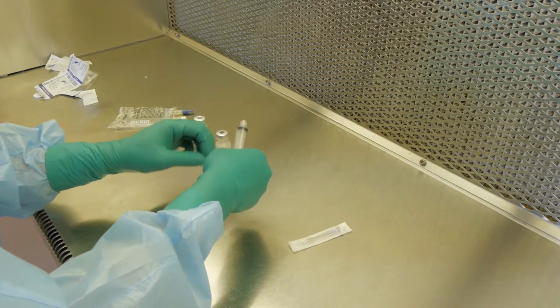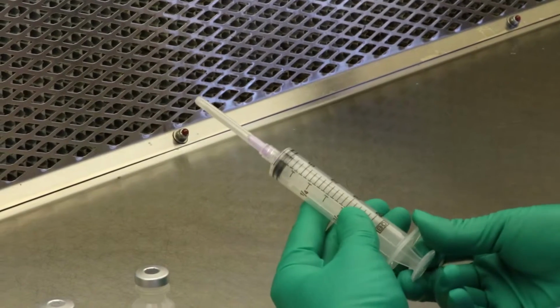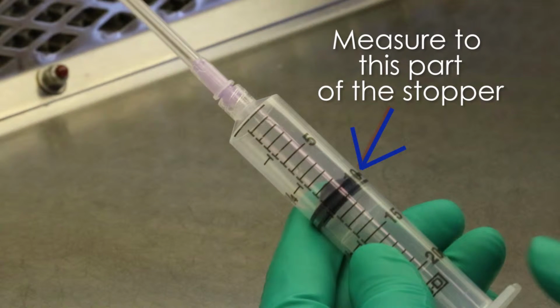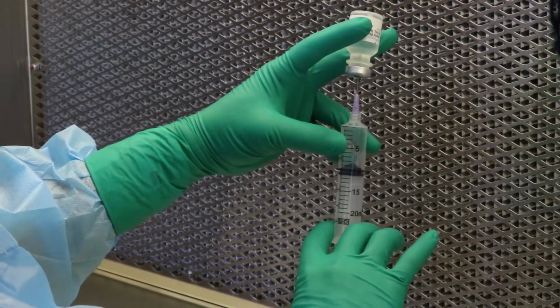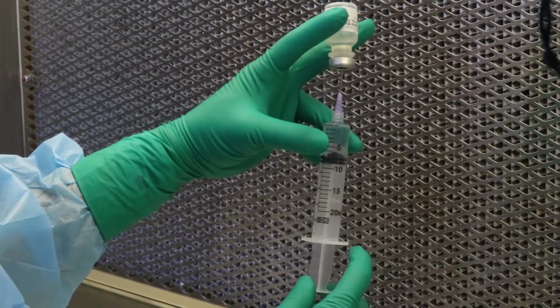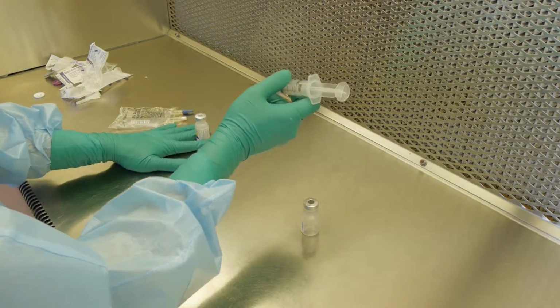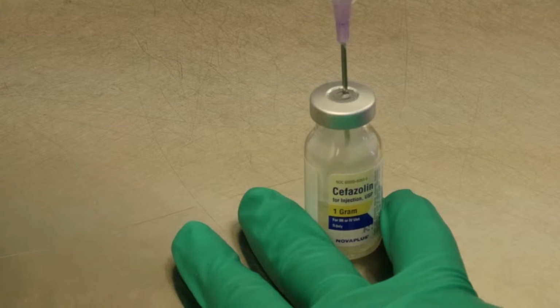Assemble a new syringe. Since this preparation needs 10 mL of water to reconstitute the solution, withdraw that amount of air into the syringe. Then puncture the sterile water vial with the needle bevel side up at a 45-degree angle and withdraw 10 mL. Inject 10 mL into the antibiotics bottle, but make sure to also draw up that much air to keep the pressure equalized.